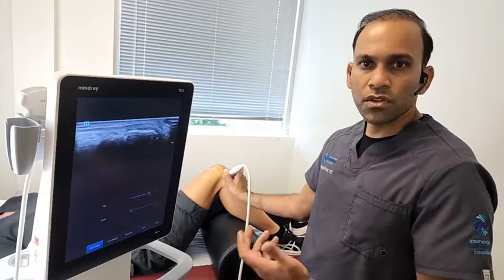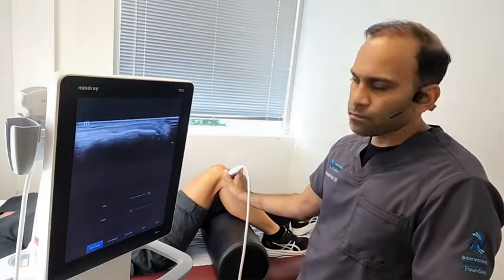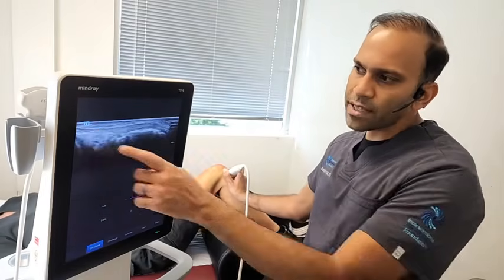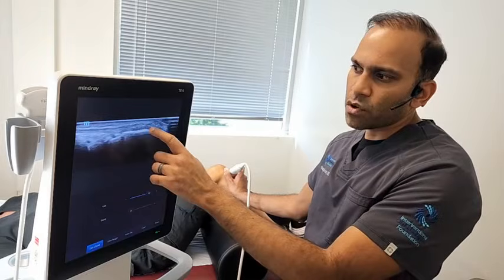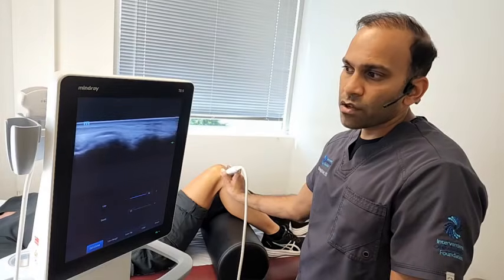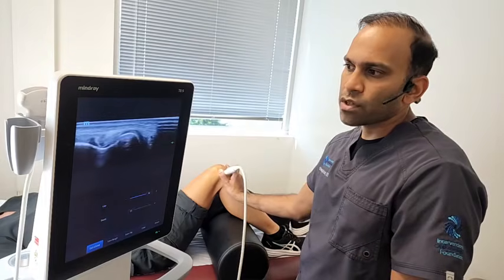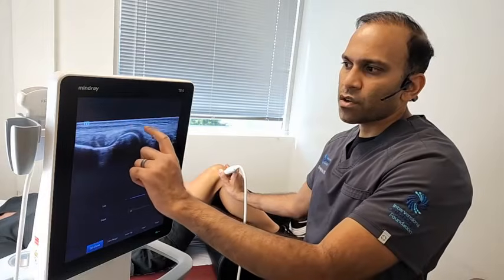And it's similar to that kind of tendinopathy picture of the patellar tendon. So here is the IT band over here coming across the top, attaching onto the bone over here. And that actually looks really healthy. So as we're traveling back towards the femur, so now this is the femur, and this is the iliotibial band coming across the top here.